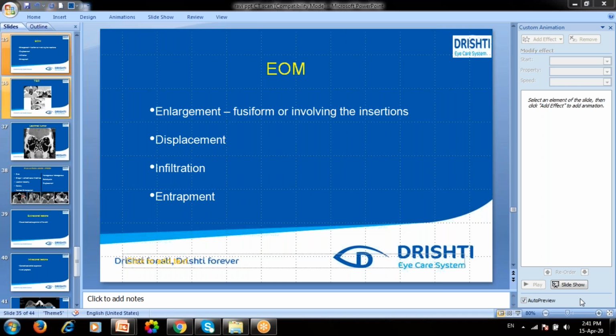So there are different types of CT scan machines, but if you write which type of report you want, the radiologist sends you the same report. It doesn't matter which CT scan machine you use. It totally depends upon which area you want. So your clinical evaluation first has to be done.